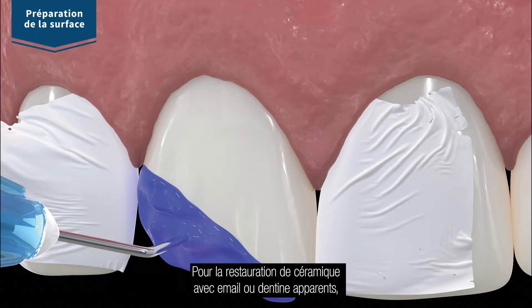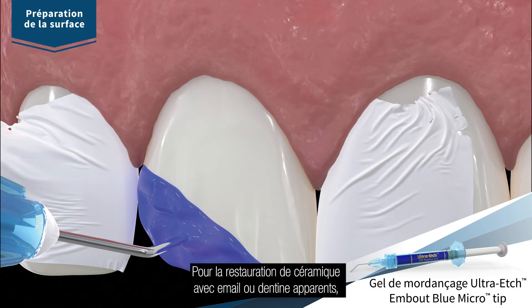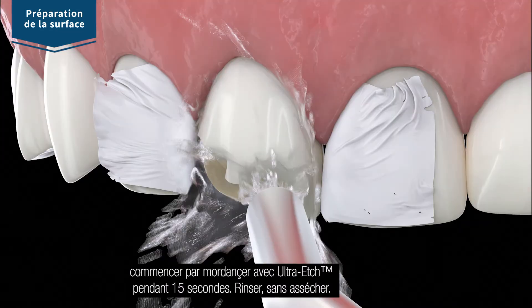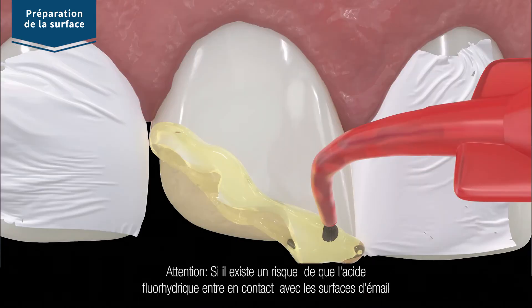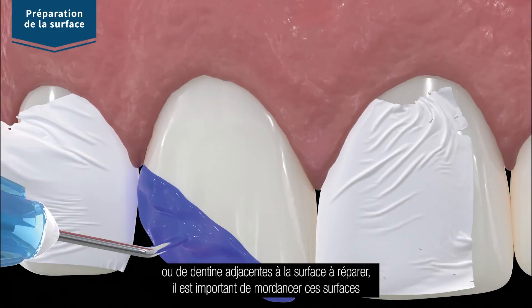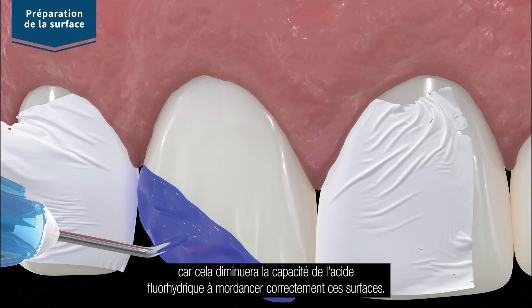For porcelain repair with exposed enamel or dentin, first etch the tooth surface with ultra etch etchant for 15 seconds. Rinse and leave moist with no visible puddles. Note: if there is a risk of hydrofluoric acid coming into contact with dentin and enamel surfaces adjacent to the repair, it is important to etch surfaces first, as it will decrease the ability of the phosphoric acid to adequately etch those surfaces.